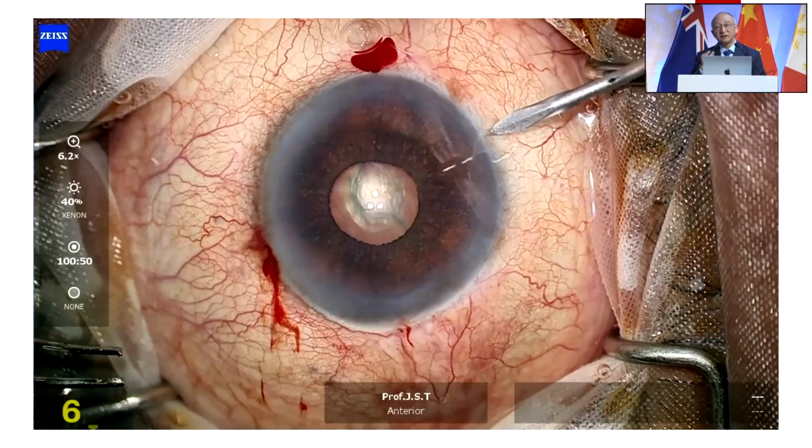Do you all understand, in small pupil surgery you might be able to complete, but putting the lens in proper axis can be really challenging in this situation. So at this stage, I thought let me expand the pupil so that my surgical area will be bigger. There are two ways to expand the pupil at this stage. One, you can go for intracameral devices like BHEX or Malyugin rings, which can expand the pupil to a desired size of 5.5 millimeter. Other thing is to use iris hooks. I normally prefer iris hooks in cases where I've already initiated the surgery, where sometimes these devices can be difficult.